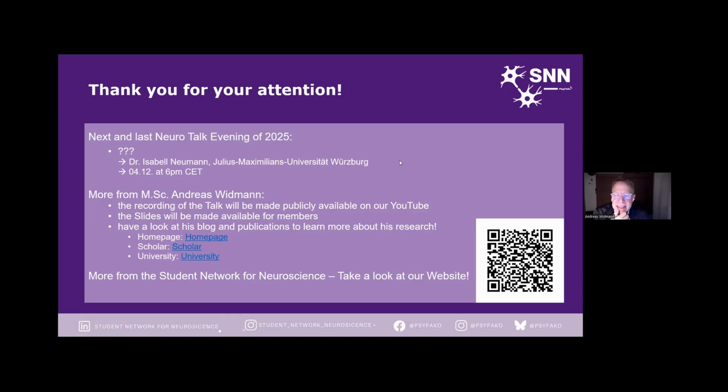Then again, it depends. In EEG or MEG, if you have a trial structure, I would not interpolate, but throw away a trial. If you have a long-term, for example sleep, data set and you have movement artifacts there, you will of course need some kind of interpolation. That is also some kind of noise. So it depends. Filtering that kind of noise can be problematic, but it can also work quite well.